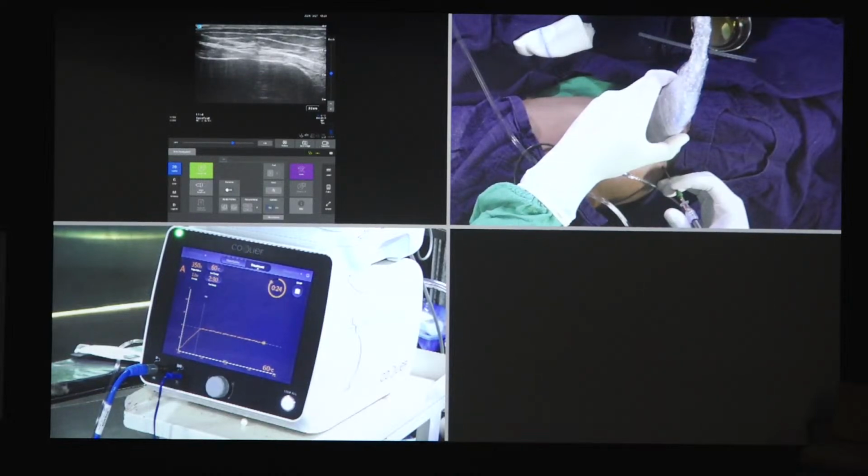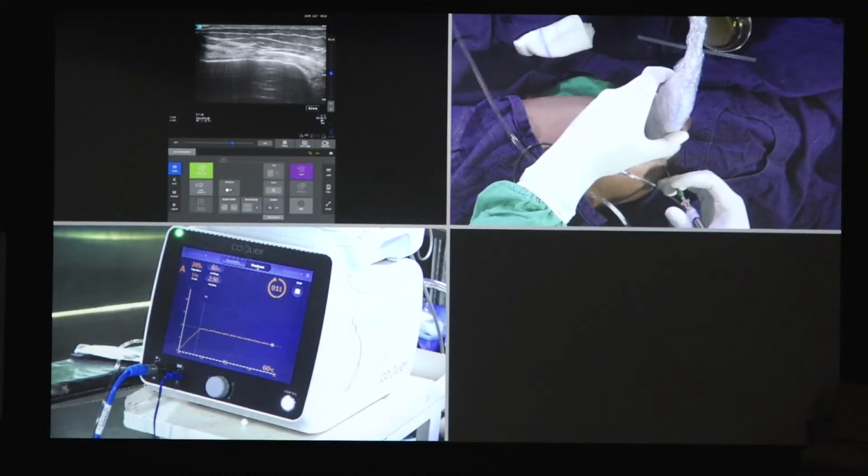We're almost done with the medial side lesioning. So after this, I'll just show you how to position for the superolateral and lateral branch of nerve to vastus intermedialis.